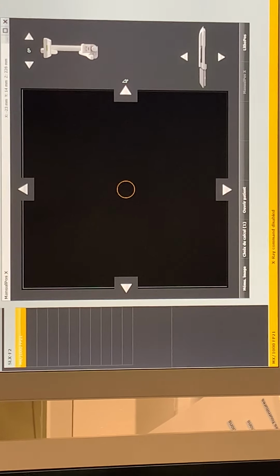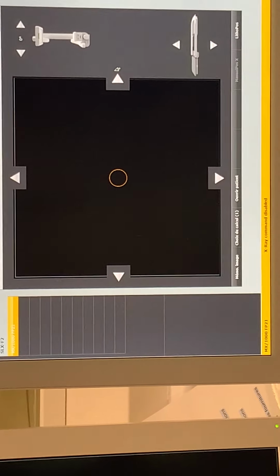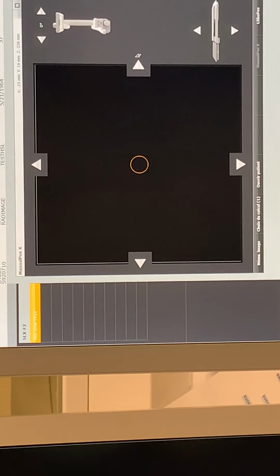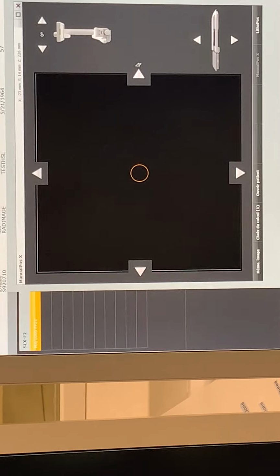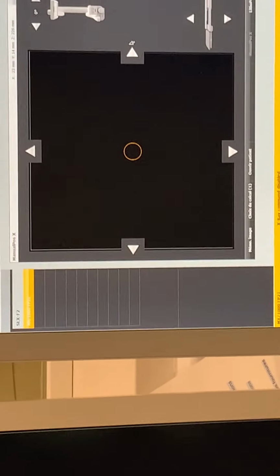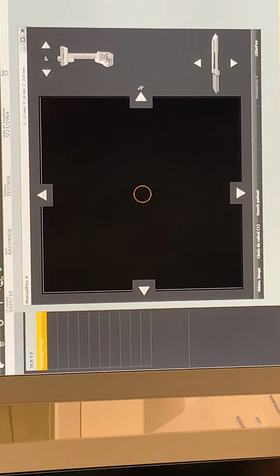The important part is X and Y, because the diameter of our shockwave is about 3 to 6 millimeters, and it is a cigar-shaped shockwave, with a depth of about 1.5 centimeters. In Z, we have much more tolerance than in X and Y.